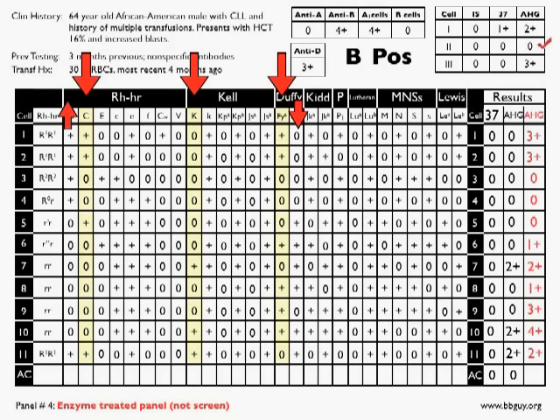So let's look over on the right, and let's see what actually did happen. Again, we're going to compare the row in red, which is pre-enzyme, with the middle row in black of AHG, which is after enzymes. And let's see what we get. All right, so in cell 1, we have a decrease. Cell 2, we have the same decrease from 3+ to 0. That same thing is actually seen down in cell 9 as well. 3+ pre-enzyme, 0 post-enzyme. So those went down very strongly. Cells 6 and 8, you had a 1+ that went down to 0. And in cell 10, you had a 4+ that went down to 2+. Okay, more on that in just a second. If you look at cells 7 and 11, you see that they didn't change at all.